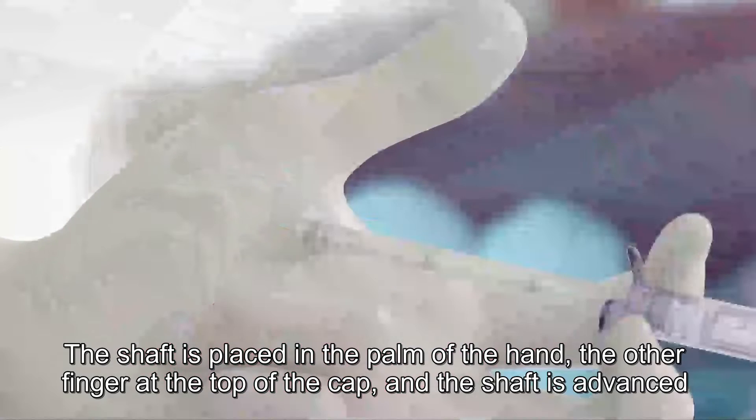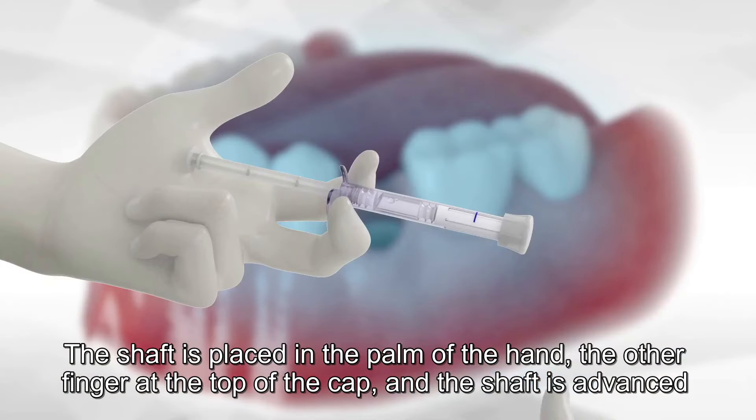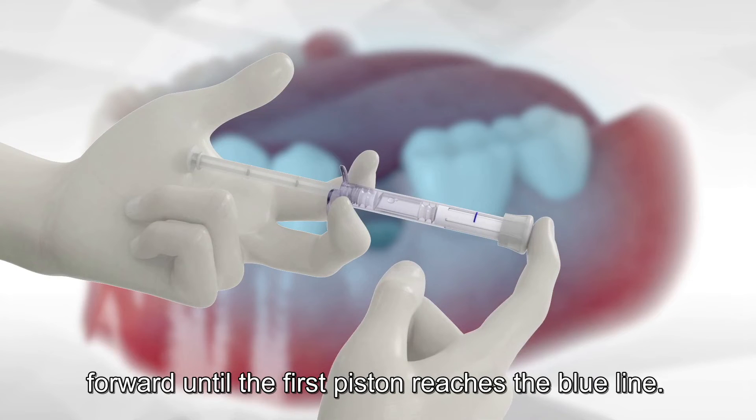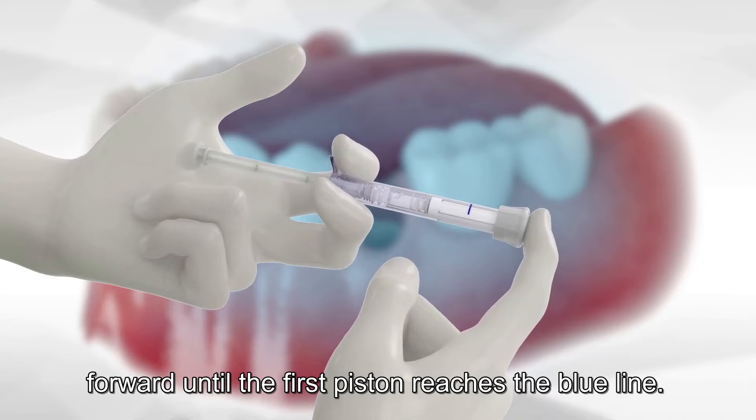The shaft is placed in the palm of the hand, with the other finger at the top of the cap, and the shaft is advanced forward until the first piston reaches the blue line.